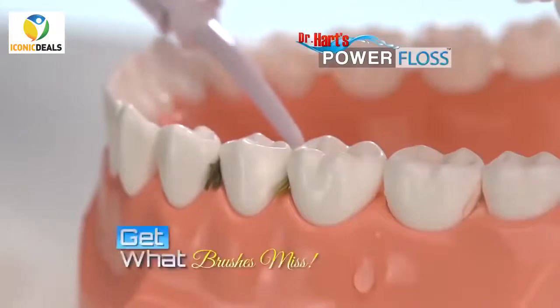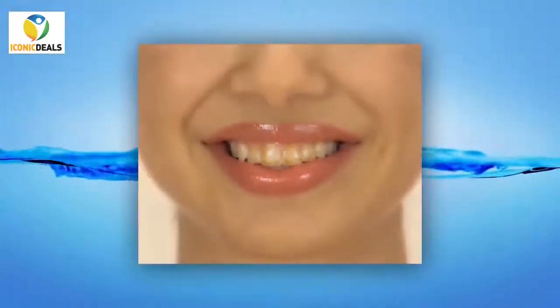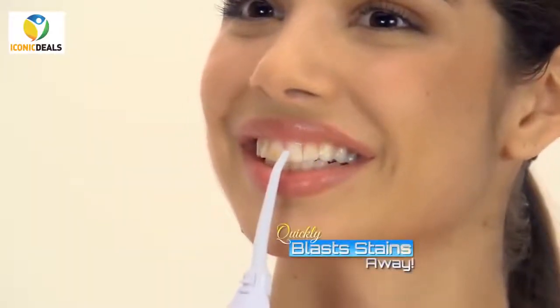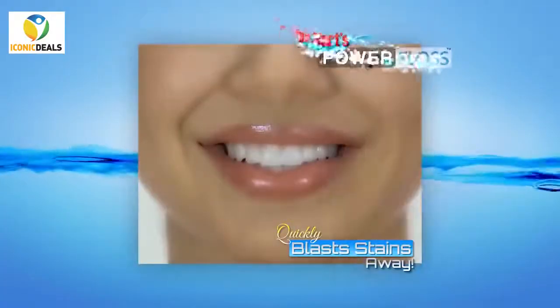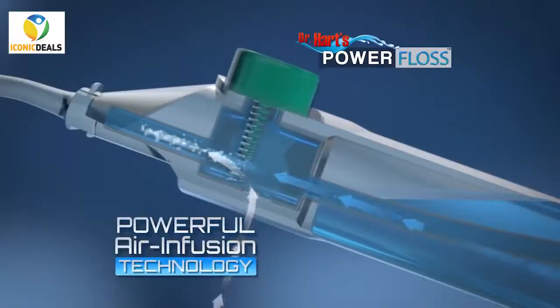Power Floss gets in between teeth to get out what brushes miss. Just watch this. These teeth are covered in coffee stains. Look how Power Floss quickly blasts the stains away, leaving them clean, bright, and beautifully white.